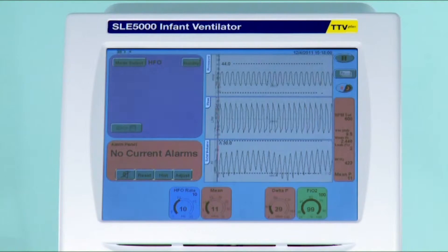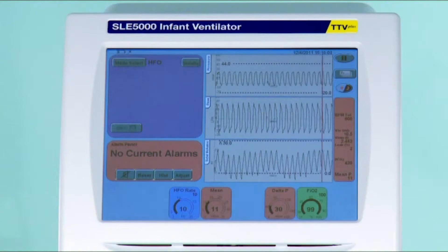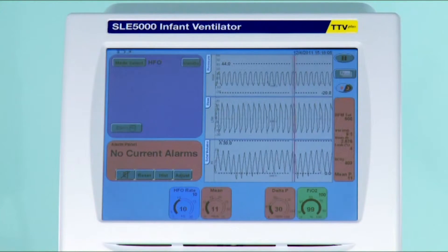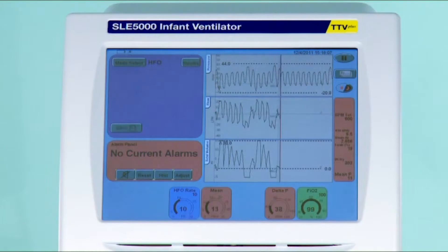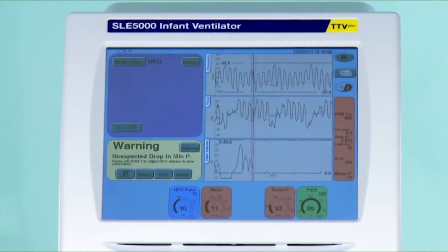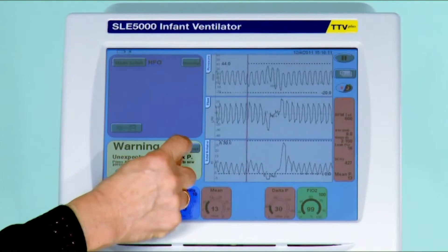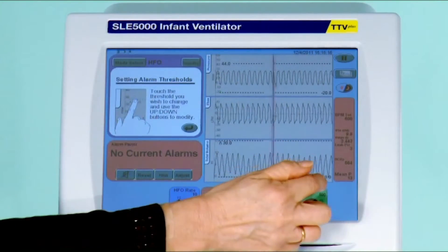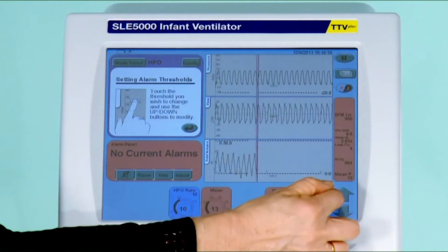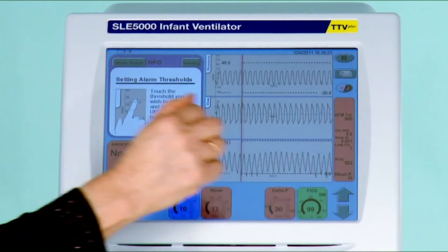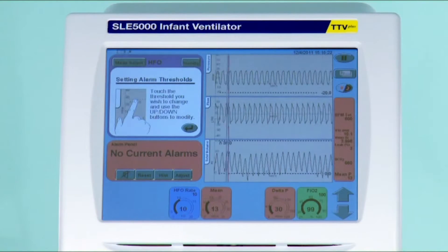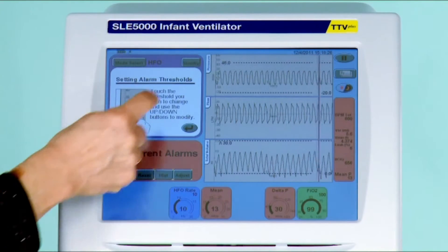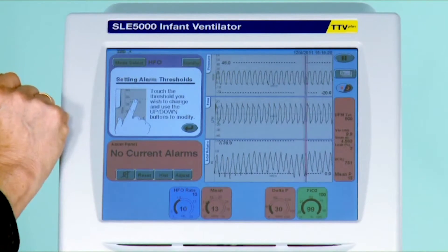The next thing you might wish to do is adjust your high and low pressure alarms. Often, particularly if you have a bigger baby who might be restless or cough into the circuit, you will get constant alarms. Therefore, I suggest that you just open up the window slightly to cater for any of these normal movements. Equally, a baby with hiccups will take the low pressure negative, so increase that window as well.